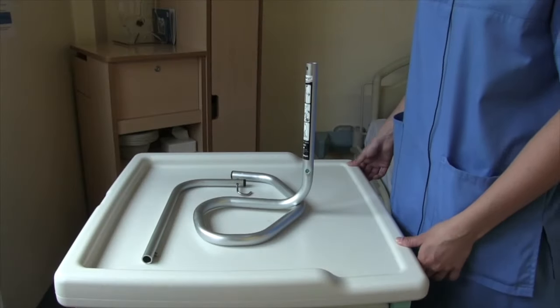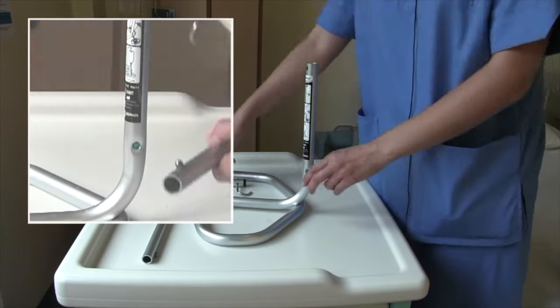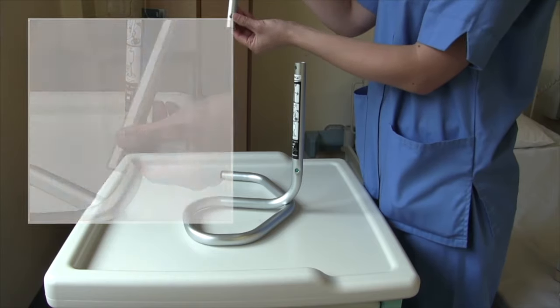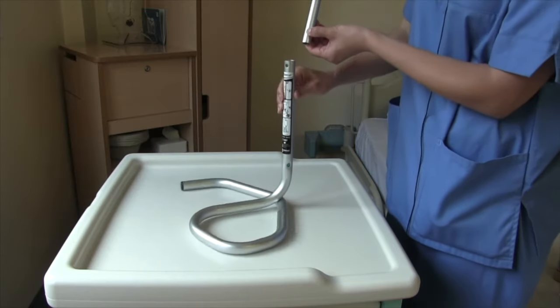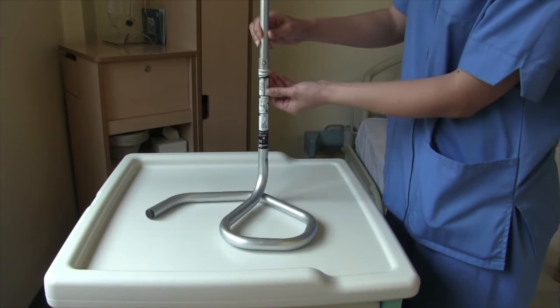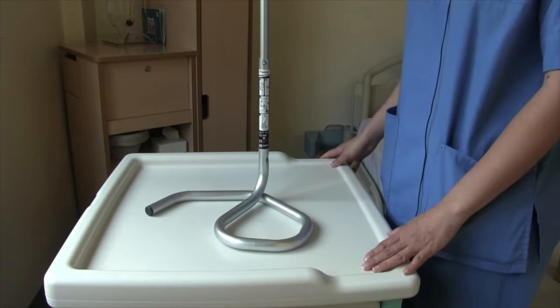Now we're going to go over how to set up your pole. It comes in two parts. This is the top part of your pole. Find the button, press it down and depress it. Slide it through until it clicks in place. And that's how you set up your pole.